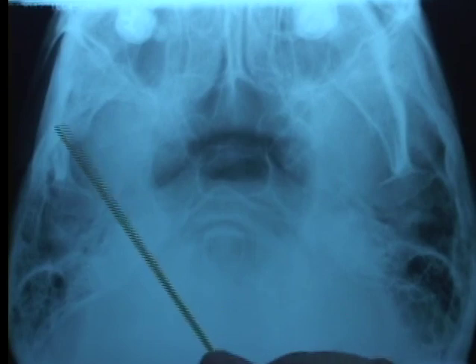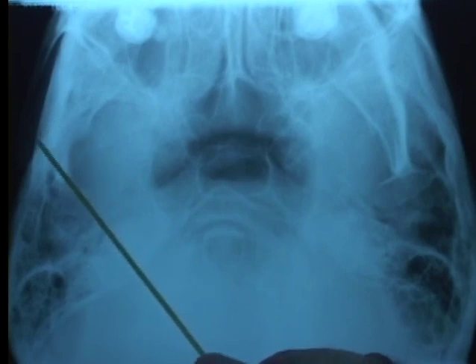left side. You can see the space between the right side of the mandible, which is right here, and the right side of her head, which is right here. And you can see that it is inset quite a distance, whereas on the other side, it almost is superimposed on the outside of her head. Also, you can see that this side of her head is more normally rounded than is this side, which has been flattened. All of these are cranial compensations to the displaced disc.